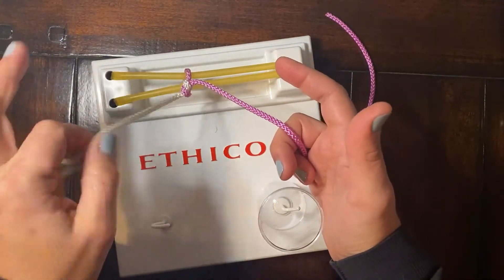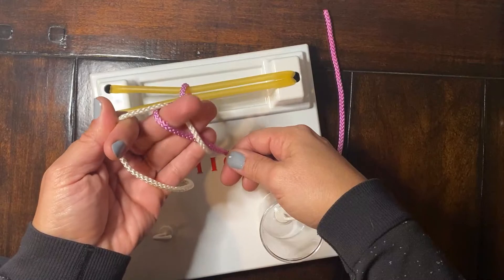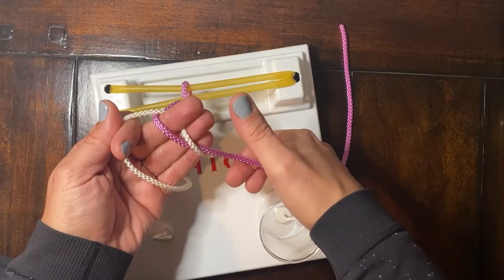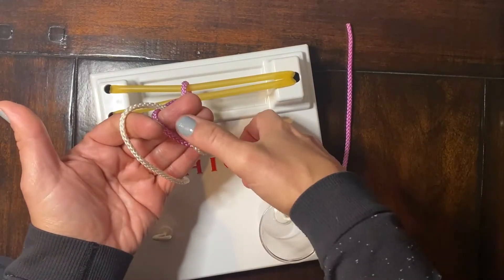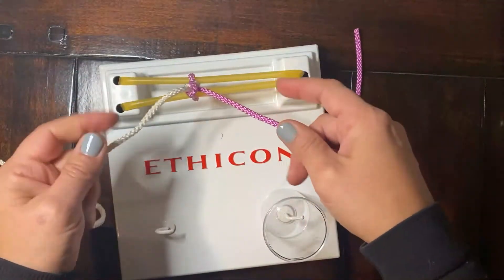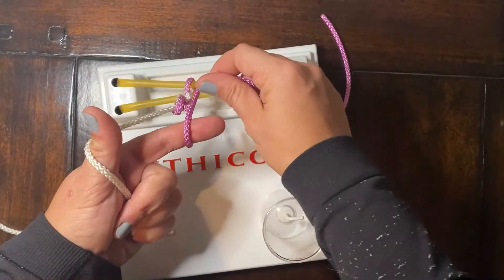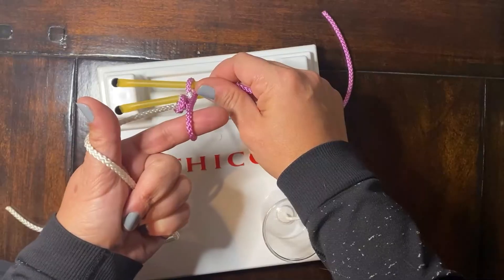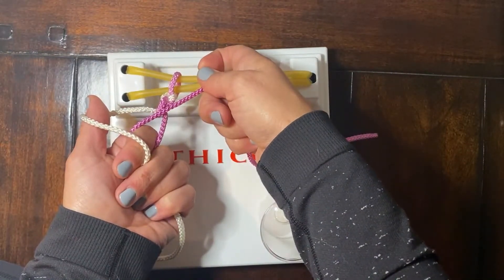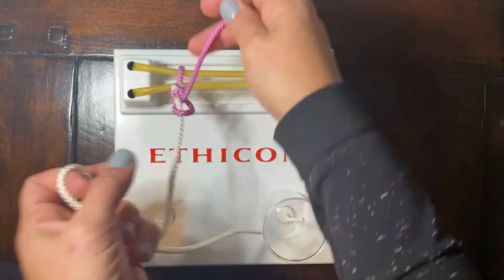Same two steps. Pistol grip, pinch, chop, drape the suture over, middle finger over purple, under white. Best way to hold this is between your middle finger and index finger — you're going to pinch the white part of the suture, so when you let go here, you don't lose it as you rotate the free end away from you. Second step of the series: pistol grip, L comes over and under, wrap the needle end or the post, index finger does the work, over purple, under white, and rotate, pulling the free end towards you.